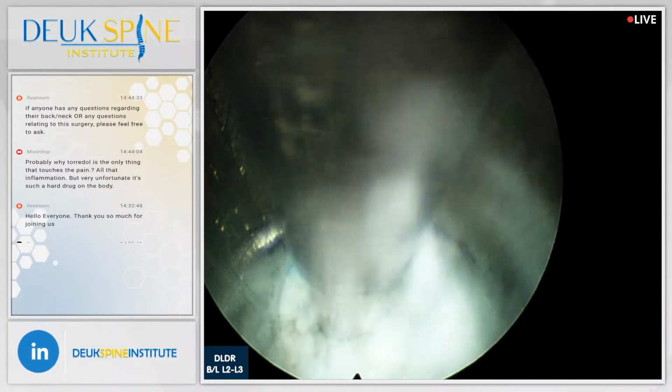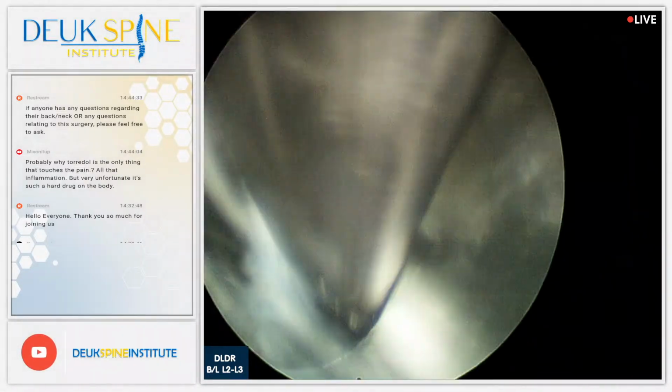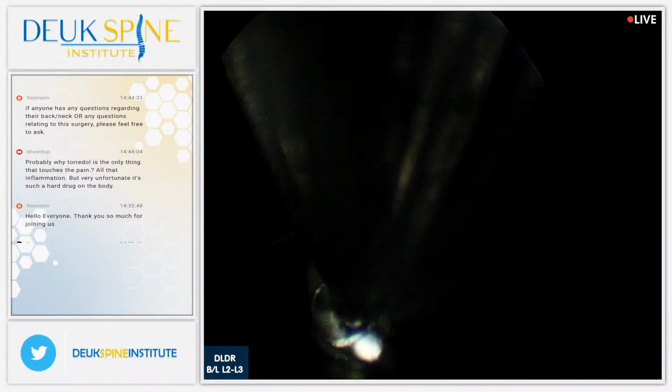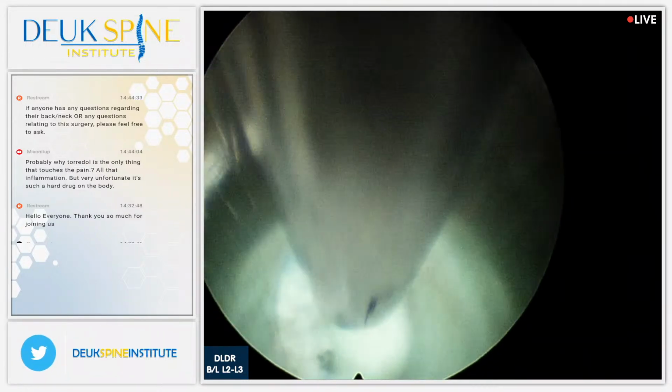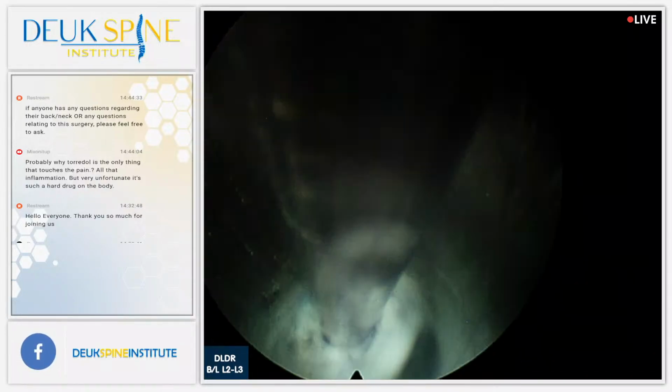We call it granulation tissue. There's a piece of herniation right there, that white thing. It's not the biggest one I've ever taken out, but it's about 5 pieces now, about that size we've already gotten. Here's some more right here.